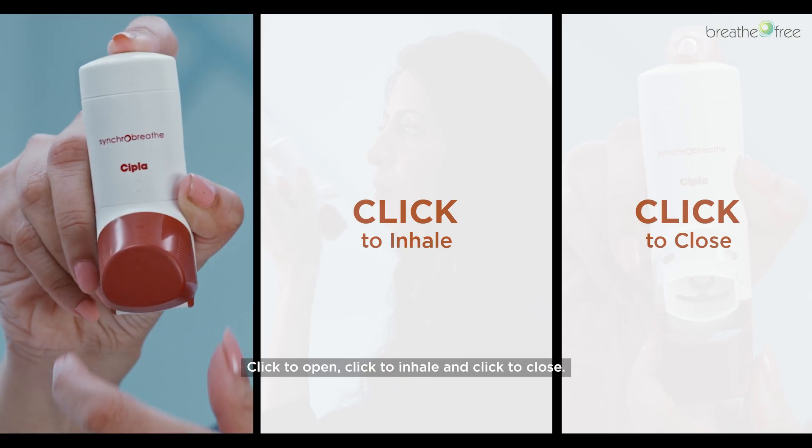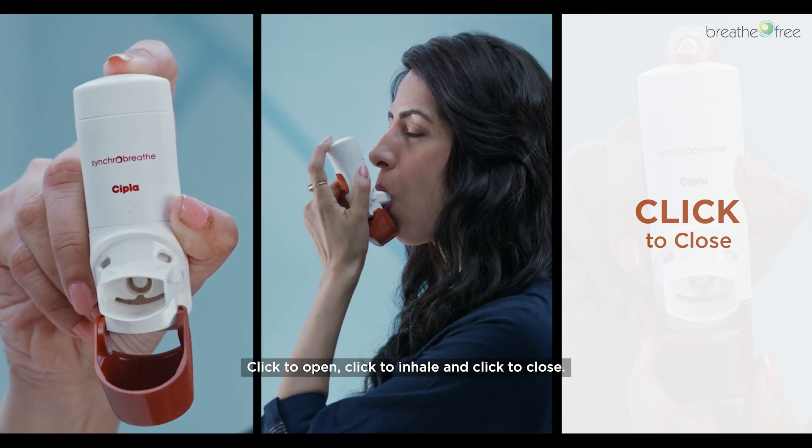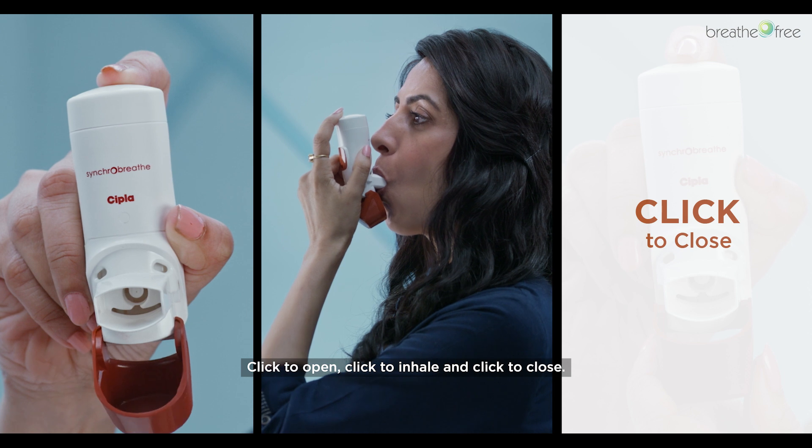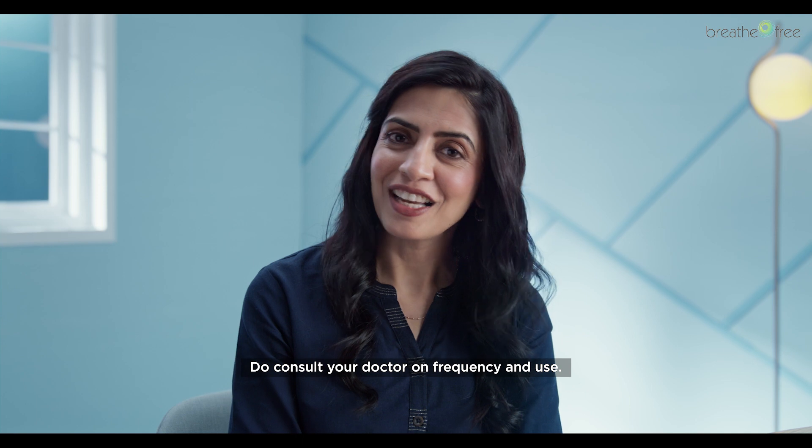Click to open. Click to inhale. Click to close. Do consult your doctor on frequency and use.